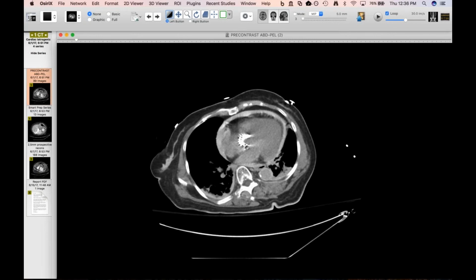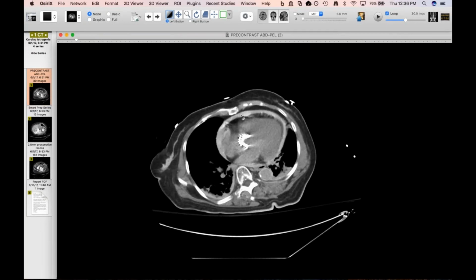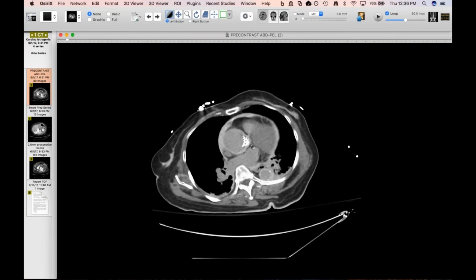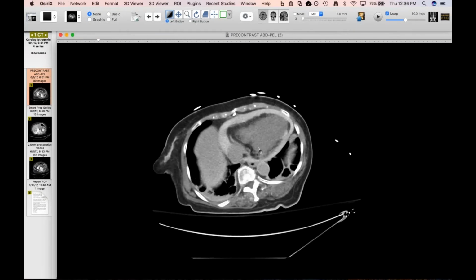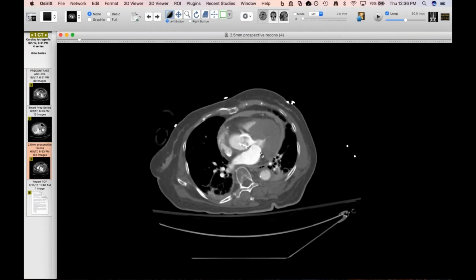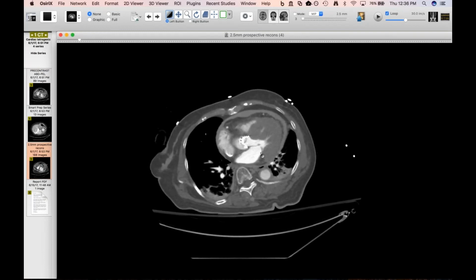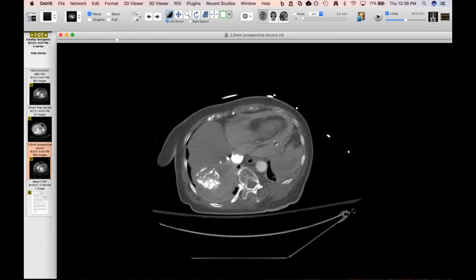They didn't find a frank site of rupture from her TAVR, but it's undoubtedly related to the procedure. And I don't know if they injected contrast that extravasated into the pericardial space, or if it just leaked through wherever the injury was, if this sealed itself up or whatever. But anyway, I don't know. They did this study, and so clearly the reason she was having ischemia type symptoms was just reduced output from this, and there was no pseudoaneurysm, no rupture of anything that they could find. So they went to the OR, evacuated 300 cc's of blood, and then she just went home today.